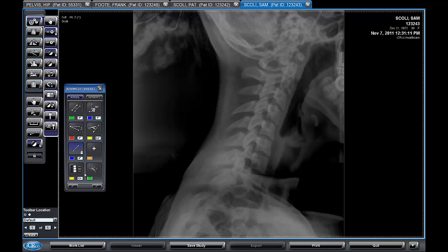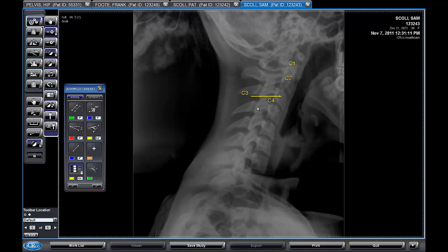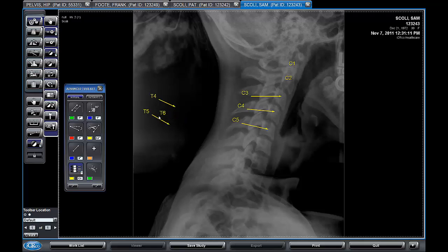We have a spine labeling tool that allows you to determine your starting region and direction. You activate this tool with a click, then place the labels with a single click, or you can drag to place an arrow. You can also use the mouse wheel to change your labels. You can click an existing label to turn off spine labeling.